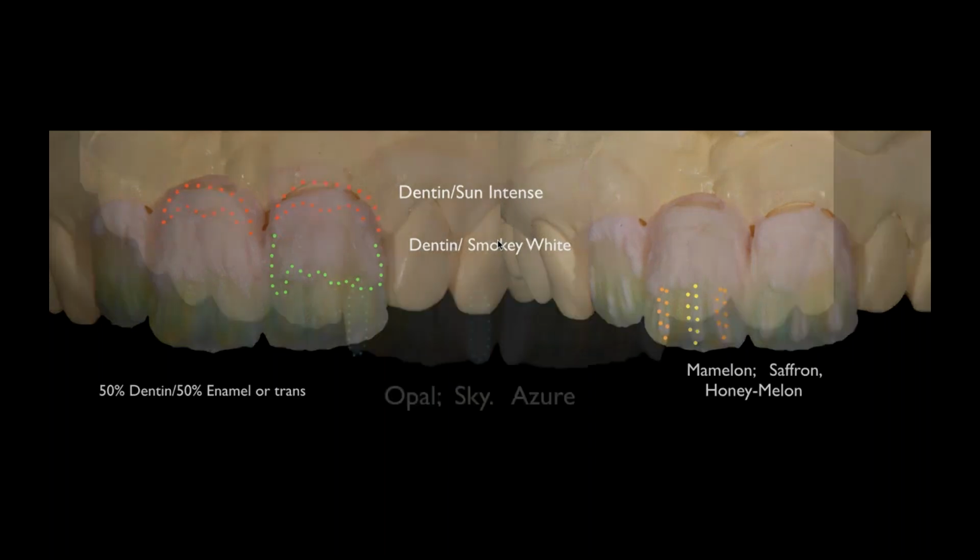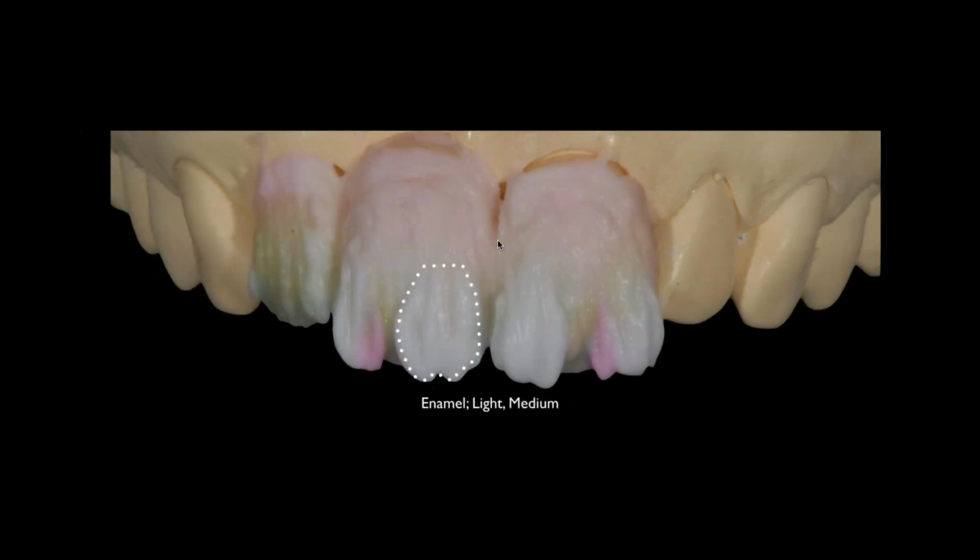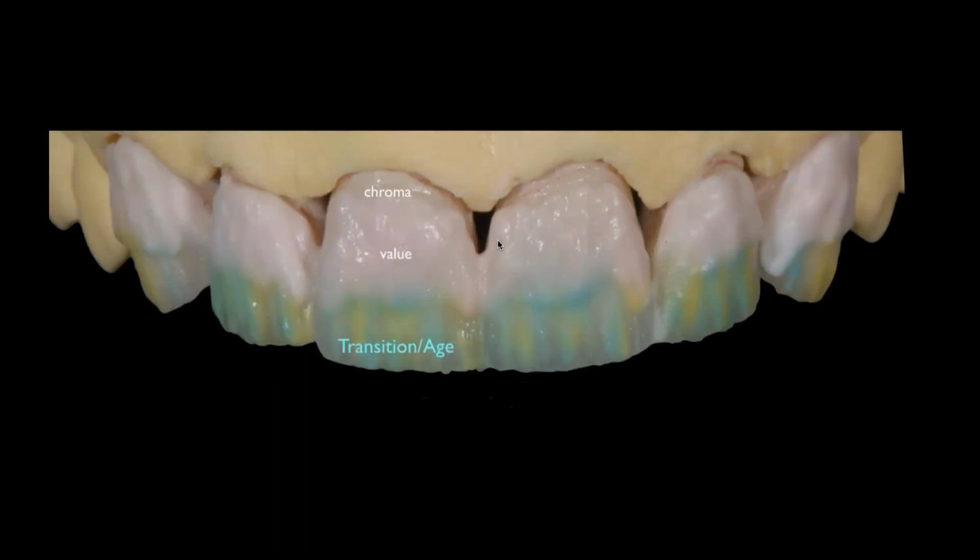Okay, and then when I get into the enamels, and I told you I'm kind of skipping the enamels a little bit today, but in the enamels, I treat them a little bit different. In the last slide or two, I'll address that with the enamel systems. I think I have a different take on enamels compared to the way most people teach them. So I really want to stay more focused on the internal right now, but I do use obviously lots of different enamels, whether it's opals or just pure translucent. Again, it really depends on what you're looking to achieve, and I'll explain that more in the last few slides.